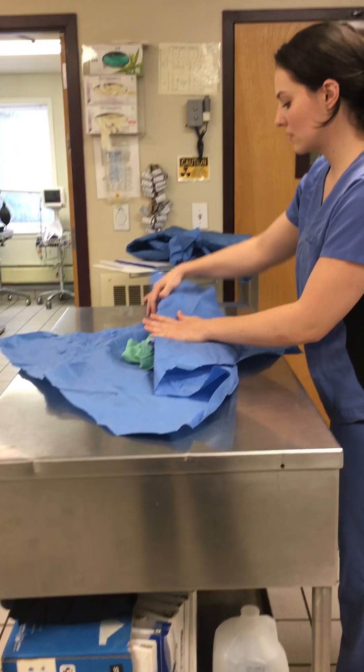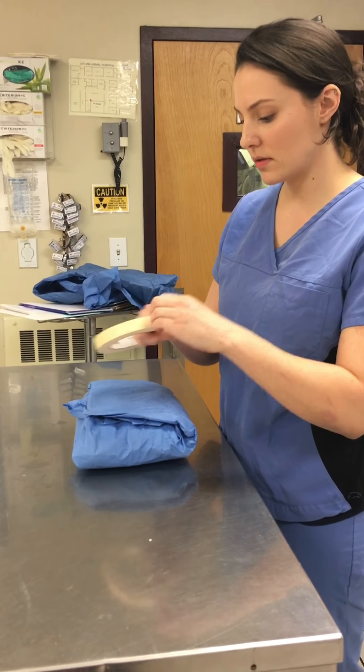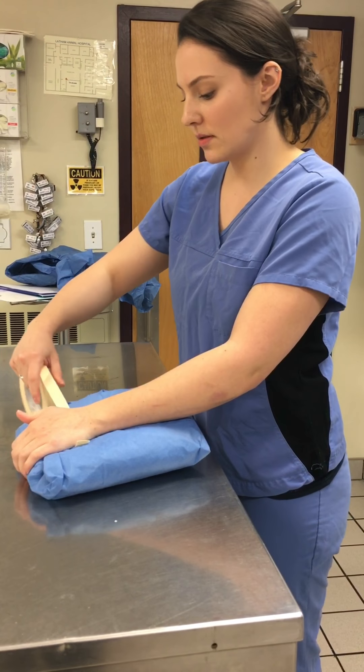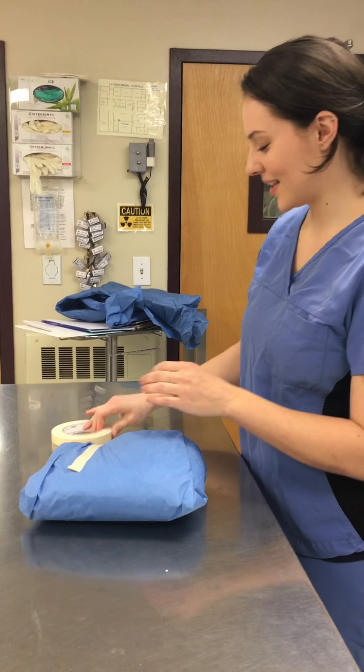It's going to be the same exact process as the first layer, so we'll do that quickly. Up. Down. Create a collapse. Make sure everything's tight and flat. Take it in one more time. Put it in here. Make sure everything's very tight. Take it in one more time.